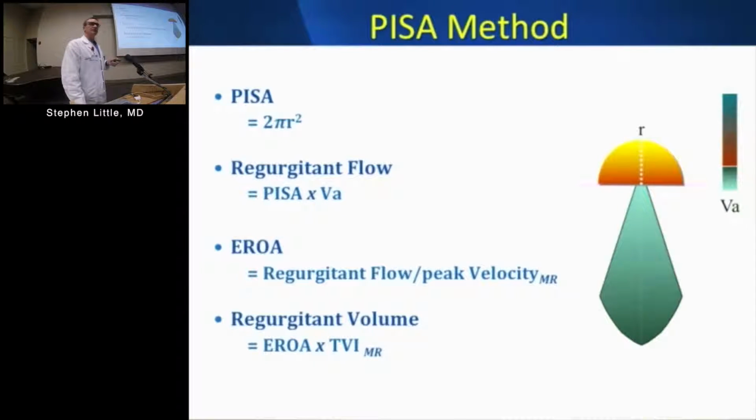So really, the concept is sound if you're applying it most typically to primary MR, calcified MR, where you're more likely to have a roughly circular orifice. If you've clearly got functional MR, this first assumption doesn't work, so that's why you're going to underestimate it. But if it's typically a degenerative MR, a roughly circular hole, that holds true.